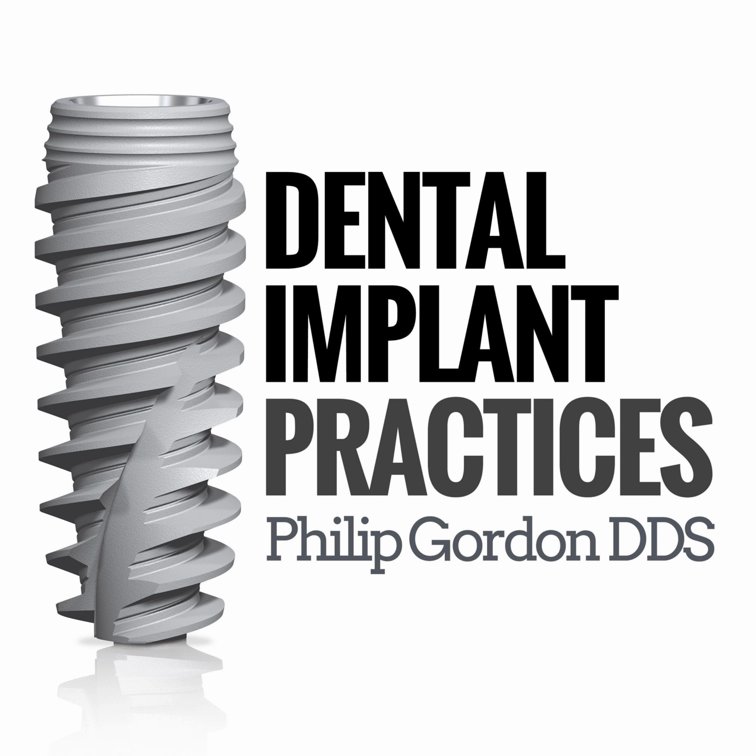So I don't do the final restorative dentistry. That's not what I do, I'm a surgeon. But when a patient comes in, let's say, on Monday morning having broken off tooth number 8 at the CEJ over the weekend, we're taking out the tooth, we're placing the implant using guided surgery, and then we're able to place an immediate provisional, a single-piece screw-retained provisional made with CEREC, and deliver that at the time of implant placement, which is usually a couple of days later. And so we're doing custom provisionals in cases like that.